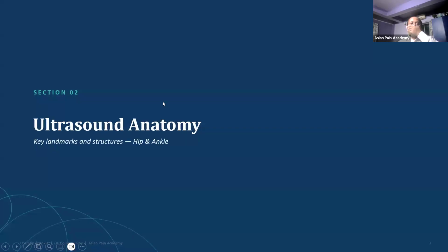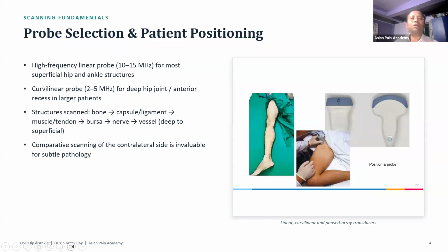Now let me show you the ultrasound anatomy. Remember, whatever anatomy I have said, these things are to be remembered while I show you the ultrasound anatomy.